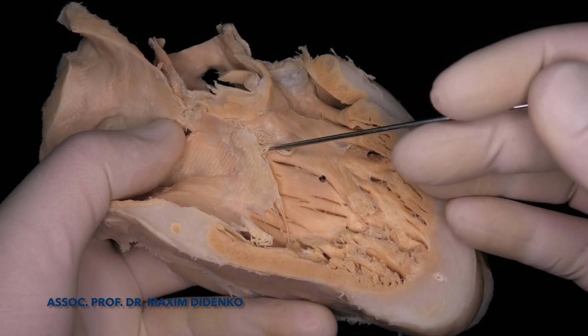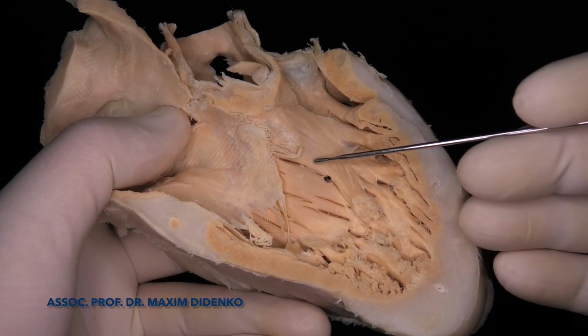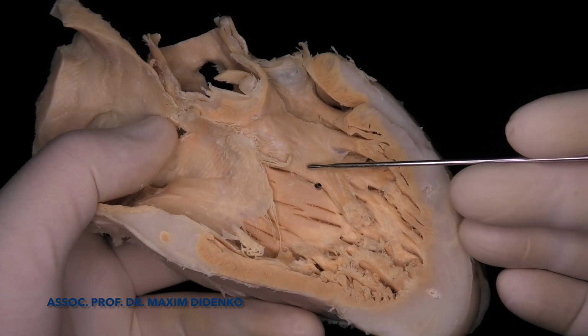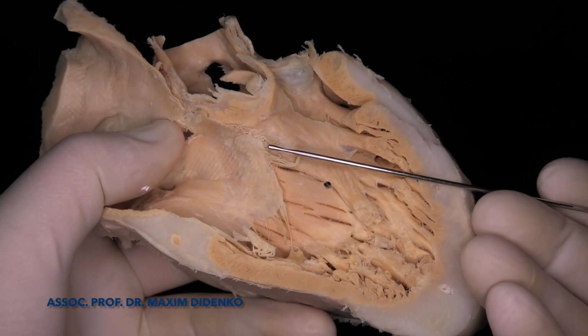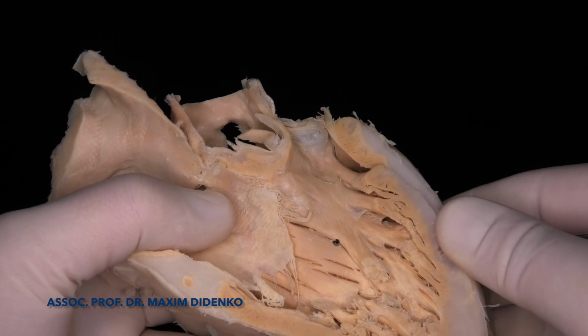We know that the right bundle is going inside the structure which we call the trabecula septomarginalis. And this is the anatomical border of the right ventricular outflow tract. So above this structure is the right ventricular outflow tract, and this is the rest of the ventricle.